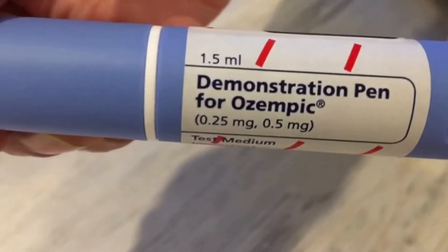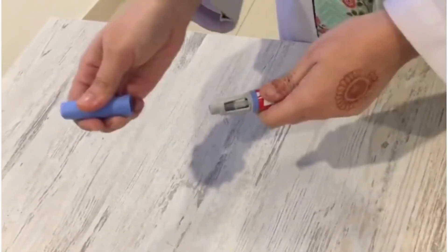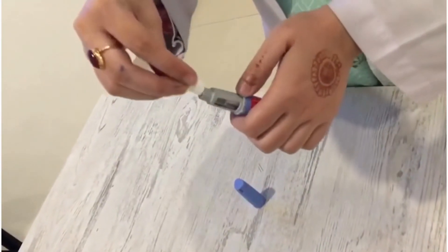This is a demo pen of Ozempic. Before you inject, first rub the pen in your hands if it is cold. Then open the cap of the pen by simply rotating it. Please make sure before injecting the medicine that the medication should be transparent.